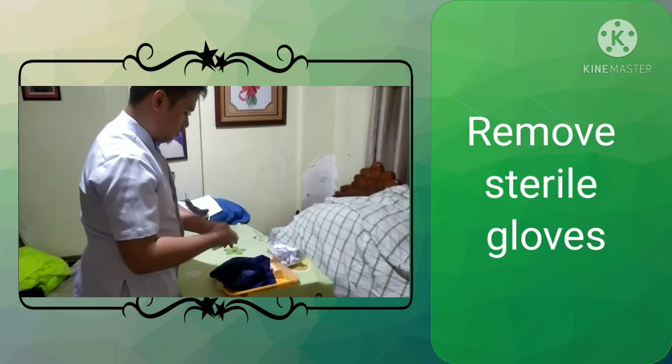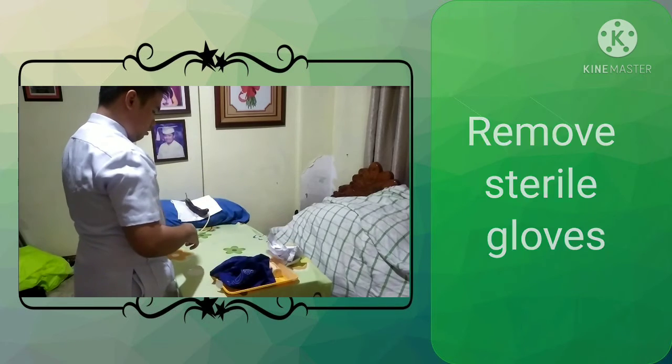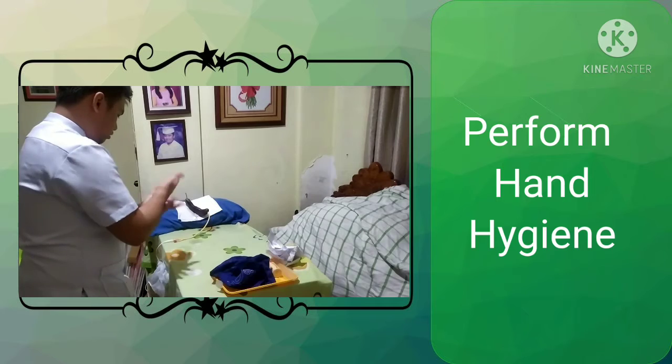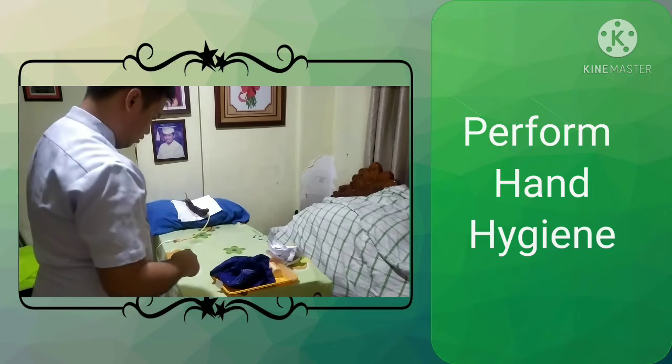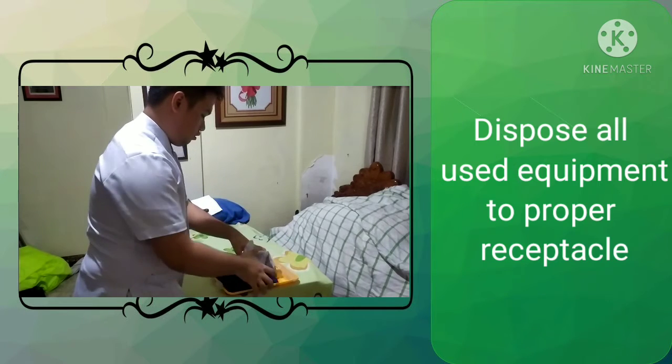Remove sterile gloves. Perform hand hygiene. Dispose all used equipment to proper receptacle.